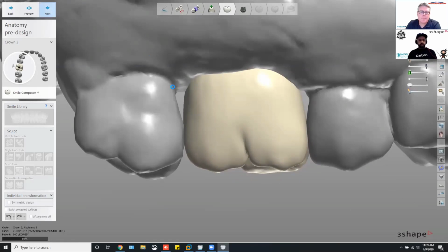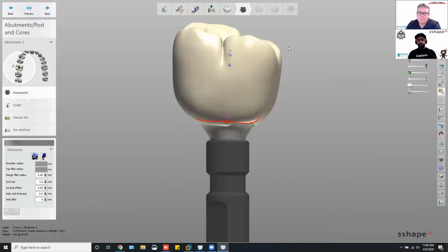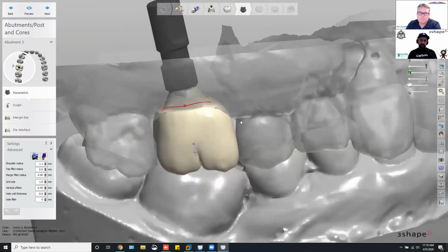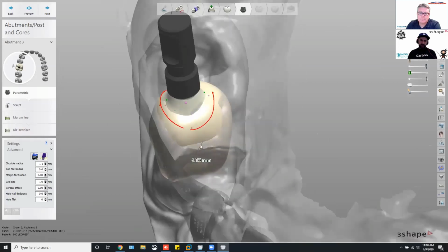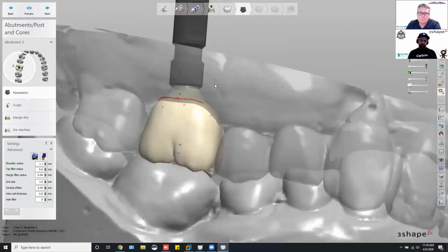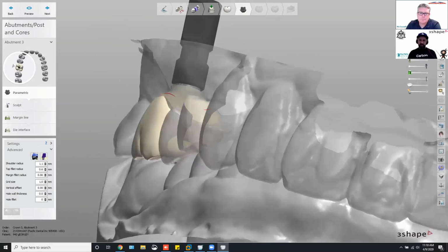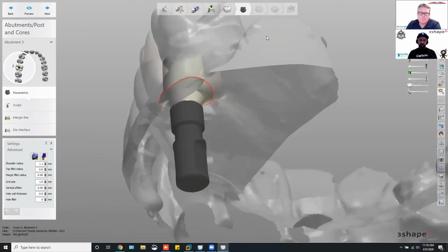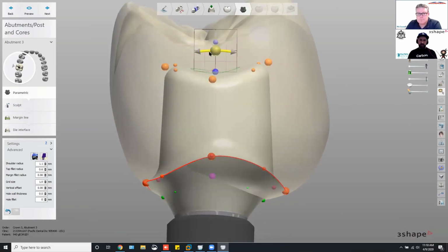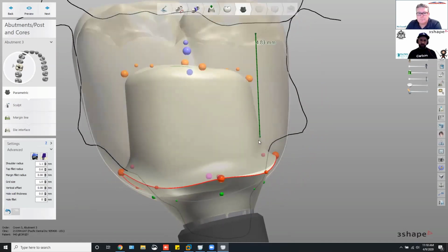So with the crown and everything set in place, you can see right here, this is a split file crown. How I normally set my contacts, a little bit, not too heavy. And we got this underneath here. With that, we'll go ahead and design the abutment underneath the crown. And we can see where, if I want to bring this a little bit more this way, get proper support.